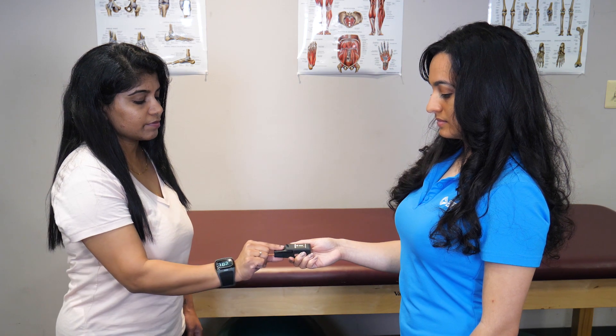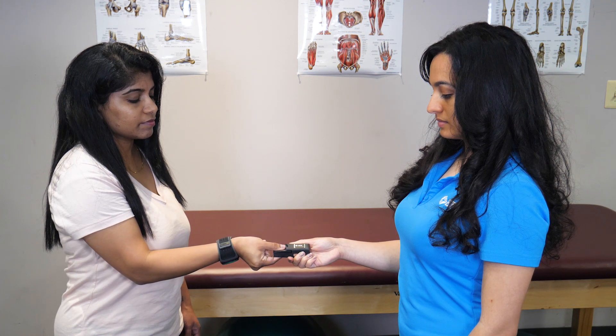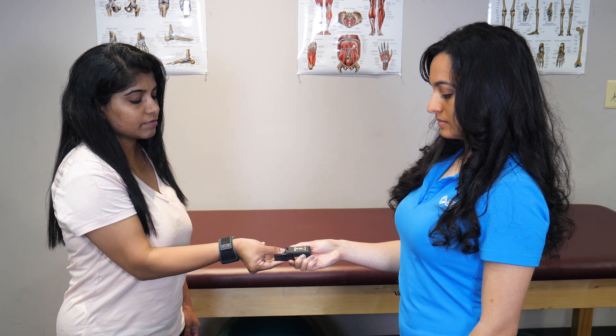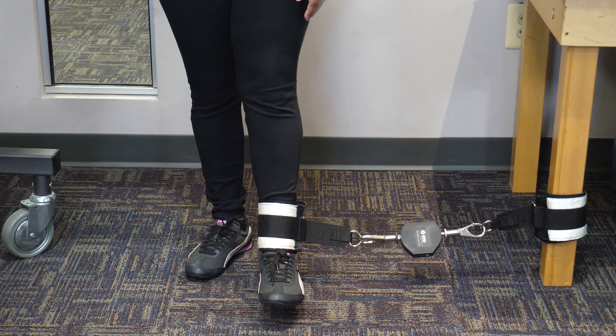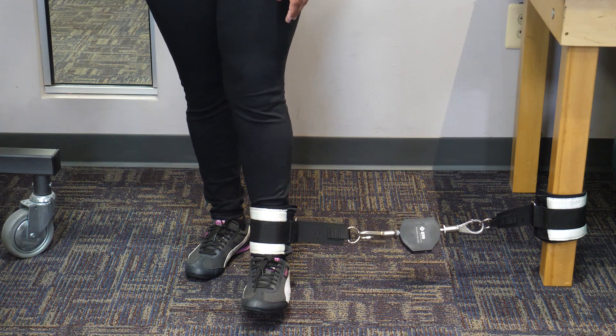With no setup, the pinch grip allows you to measure all three standardized grip tests with ease. After measurement, you can easily export the data as an Excel file for your analysis. Beyond the hand and pinch grip, you can assess strength of both the upper and lower extremities. Measure lower extremity movements like hip adduction quickly and easily.